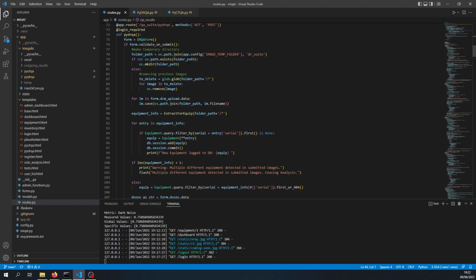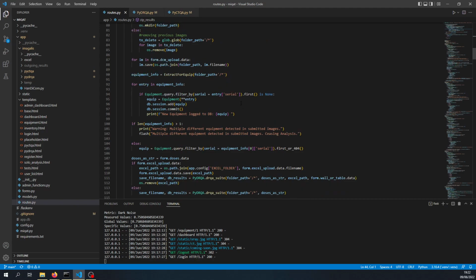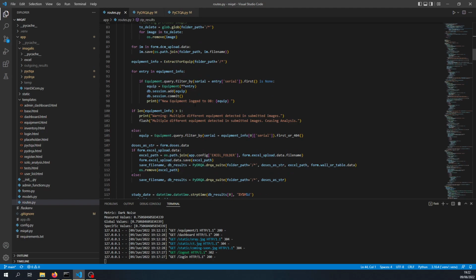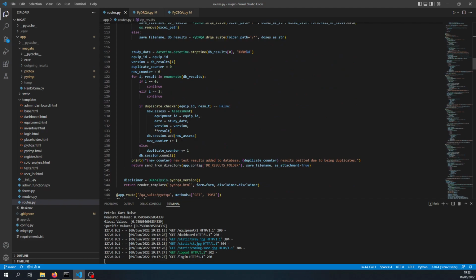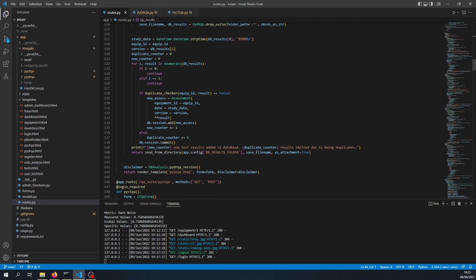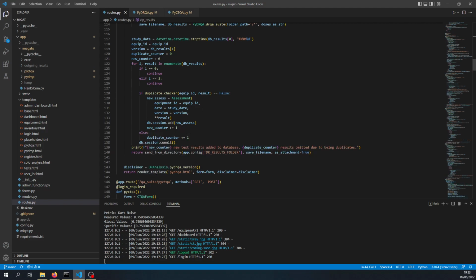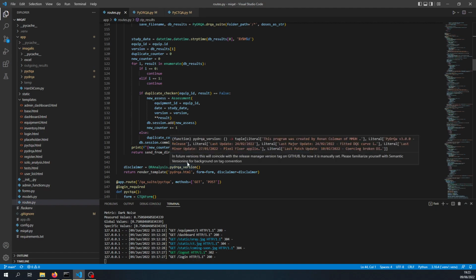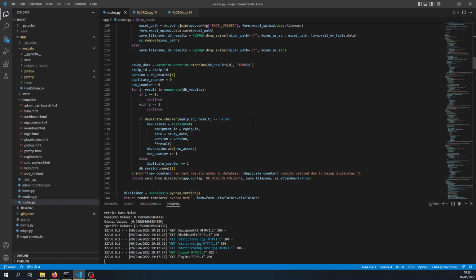Then we have our Python code in the background handling all the file management and organizing where the images are to go, as well as running it through the image quality test. Once this is complete, we'll have all the relevant data committed to a database, and it will return to the user their newly created results Excel file. Each page will also always be rendering a template in HTML for the web application to actually show the user. So this is just one of the basic ones I've done here.